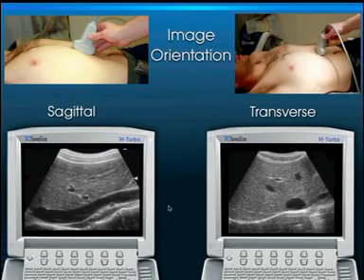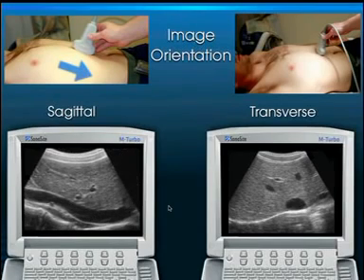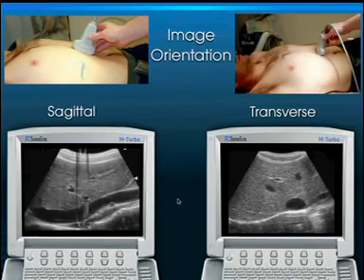But if I accidentally aim the indicator down towards the feet because I wasn't paying attention, now this IVC is upside down. While you can still interpret it, it's an upside down image and goes against the convention in the United States. Over time, that appearance should feel like fingernails on a chalkboard to you. So I'm going to turn it back right now, because it's having that effect on me.